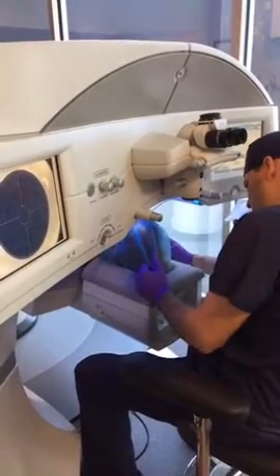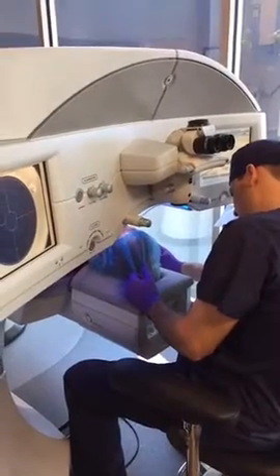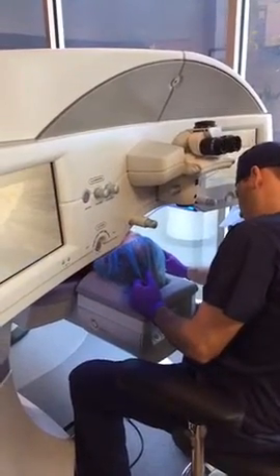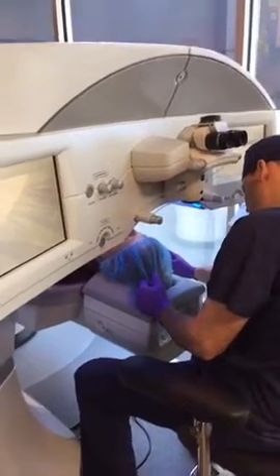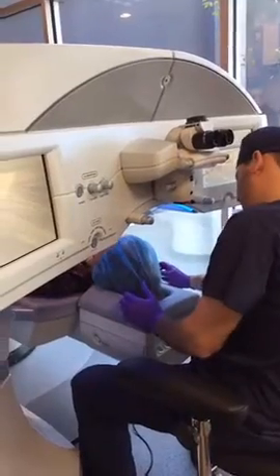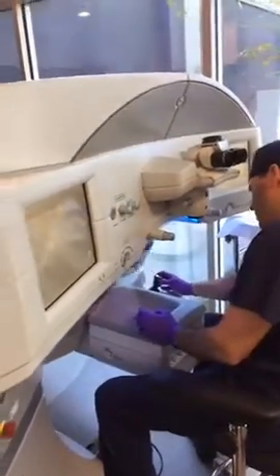So what we're going to do now is lower you down a little bit, and then we'll take the blanket away and then take a couple steps over to the second laser. Okay. So your vision's going to be kind of fuzzy. Yeah. And you can start to sit up now. Just watch your head, please, and swing your legs over to the left. Okay. Okay, great. So first step is already done.